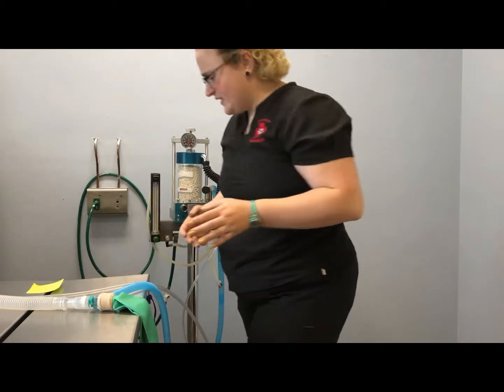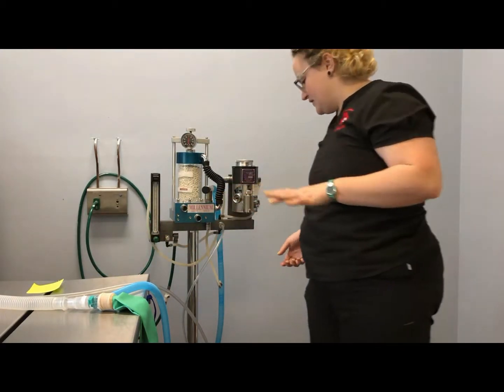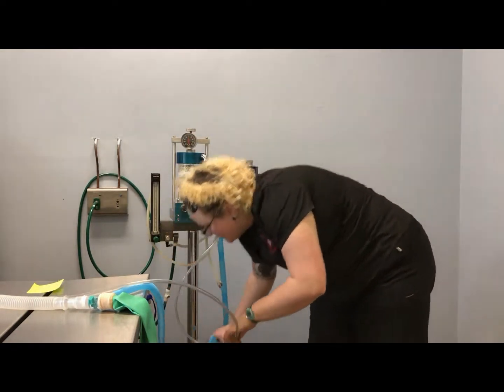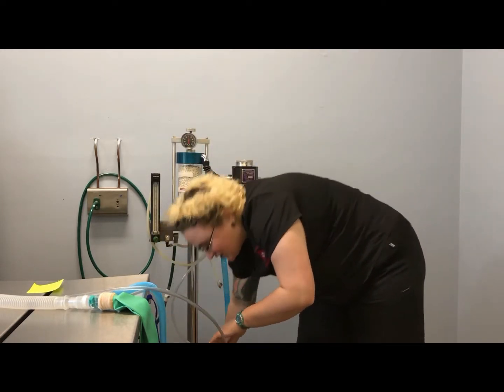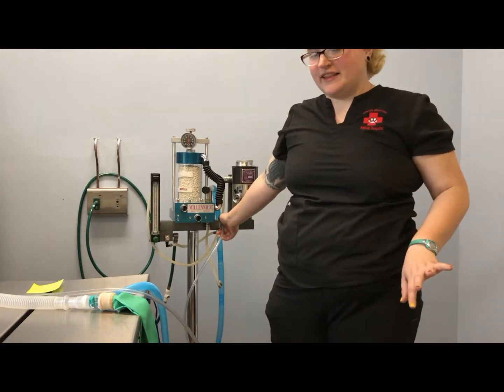To hook up our non-rebreather, we need to make sure we have two important things hooked up. One, we want our outlet hooked up into our scavenging system, which is an absorber canister on this one, and then we want our other tube hooked into the fresh gas inlet.